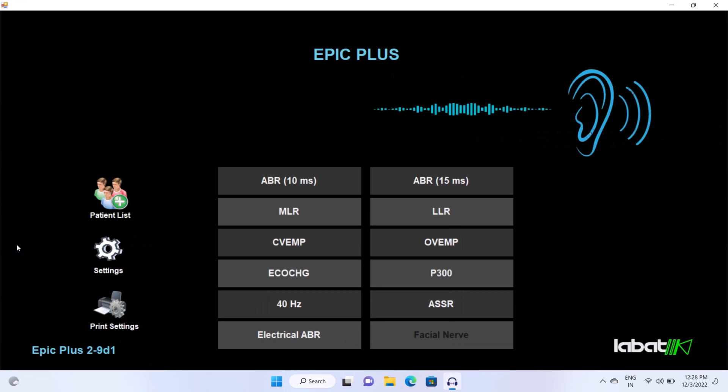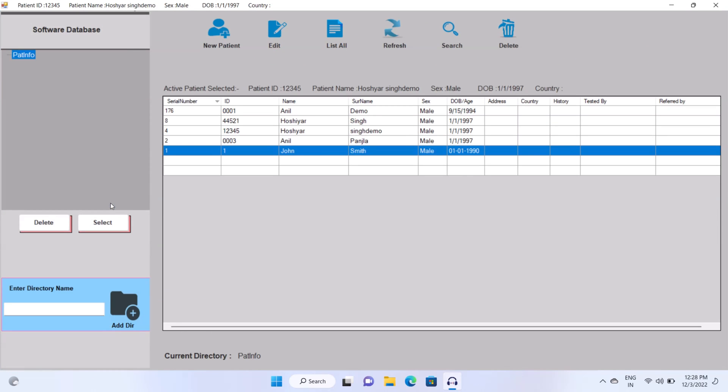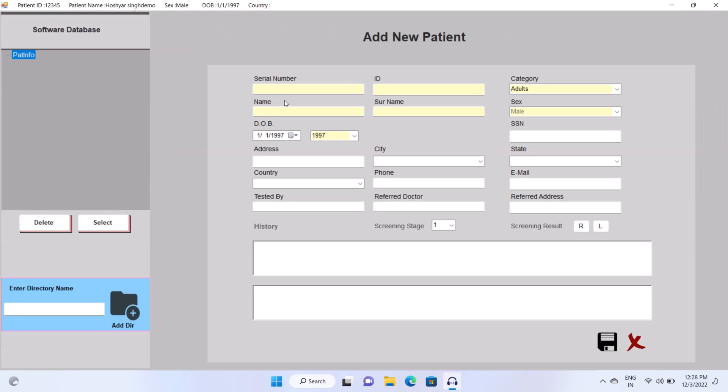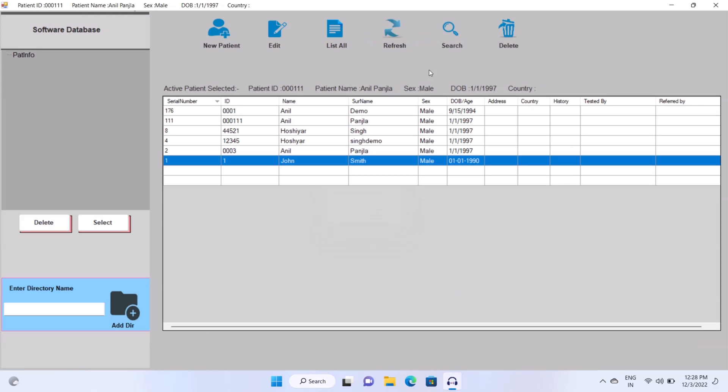Firstly, you have to create patient ID. Click on patient list, then click on new patient icon. Fill patient details. Yellow highlighted field is mandatory. After filling patient details, click on save.